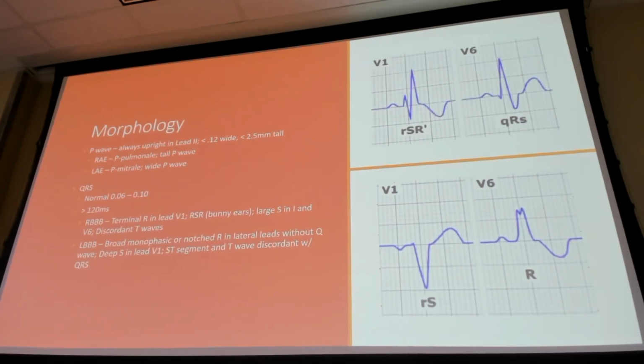The tricky part of the left bundle branch block is that it used to be a STEMI equivalent, it no longer is, but there are measurements we can take to help us identify if we still think it's acute coronary syndrome, because it can be kind of tricky when you have that V1 widen for the left bundle branch block. So does anybody remember the name of the criteria we use? It's a funky name. Scarbossa. Somebody was starting to say, yeah, Sgarbossa criteria. We won't get into it.